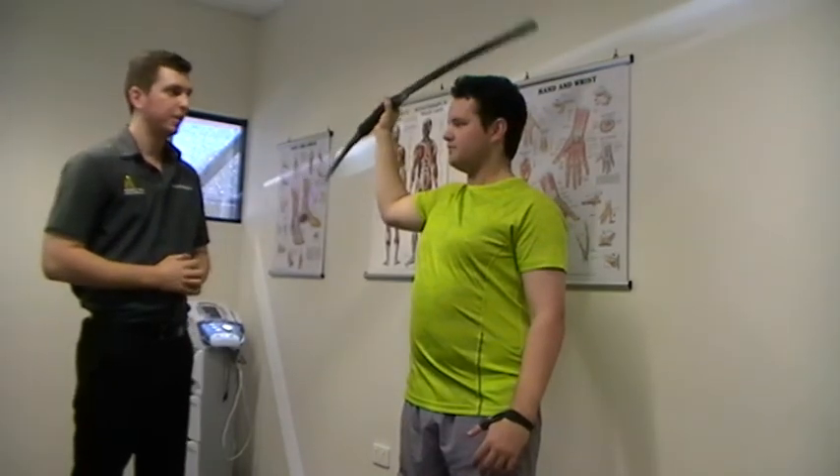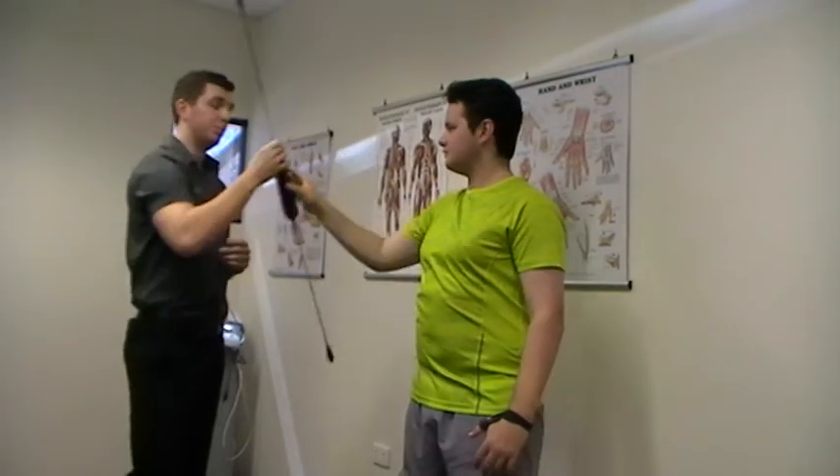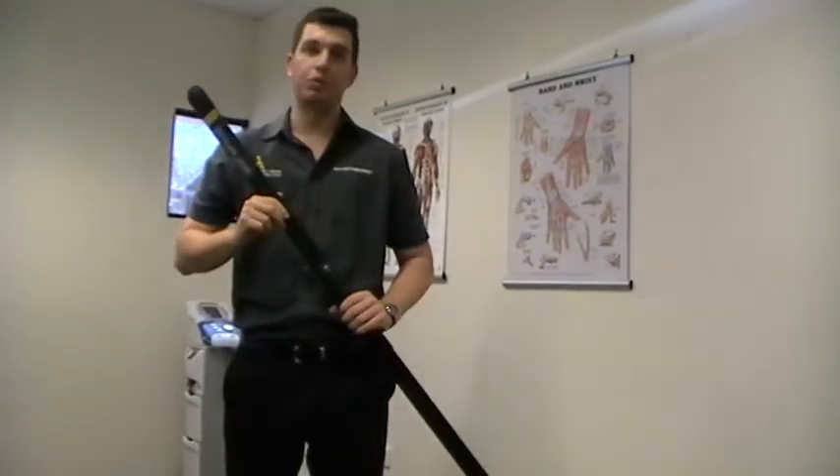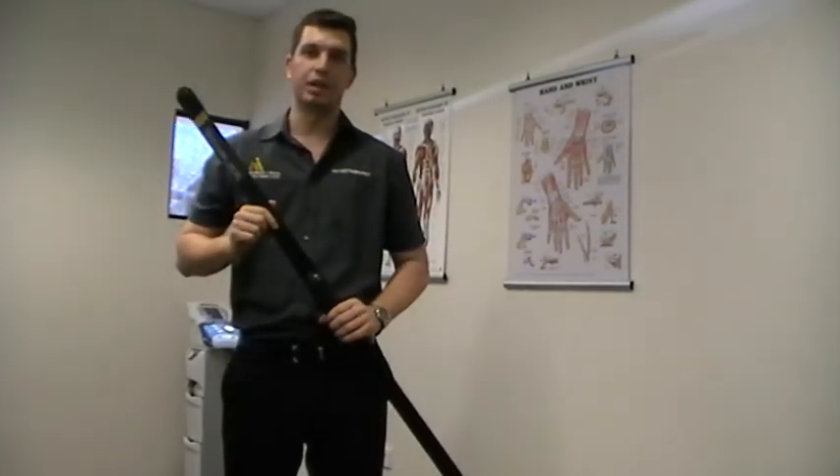How does that feel, Jordan? Very good. These Body Blades are available to purchase here at A&I Physio and they're a great tool to take out independent rehabilitation at home.